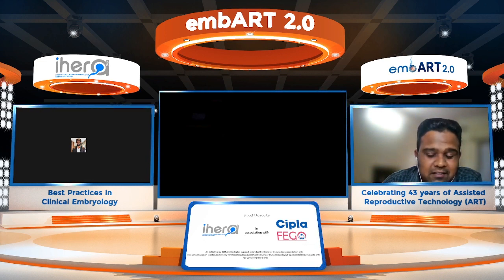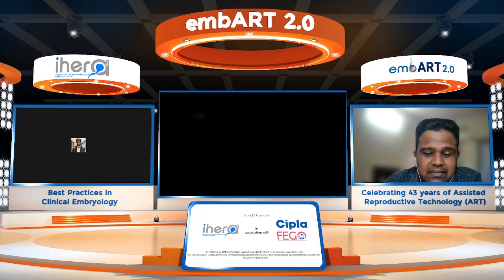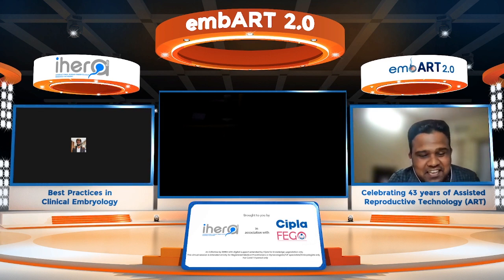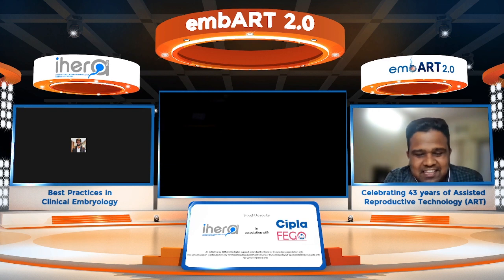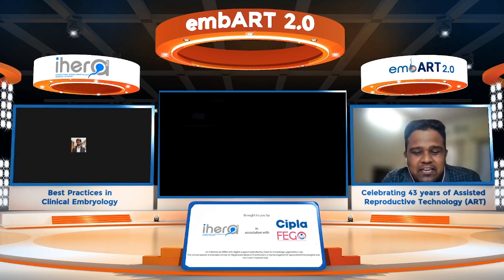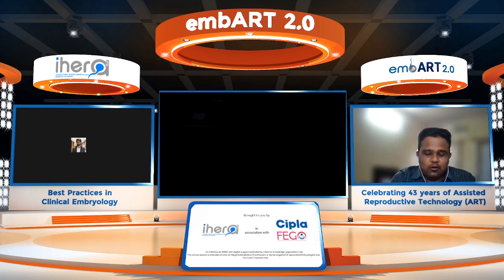But on the opposite side, there are advanced techniques like microfluidics and MACS. They are eluting out good quality sperms with higher fertilizing ability. Then what is the use of DGC? In the era of ICSI, we only require one single sperm. We don't require a good number of spermatozoa.